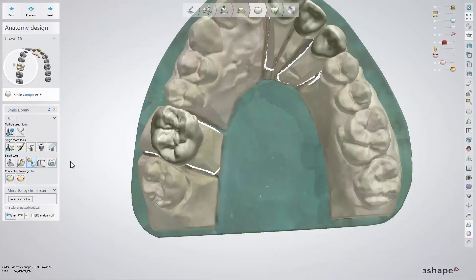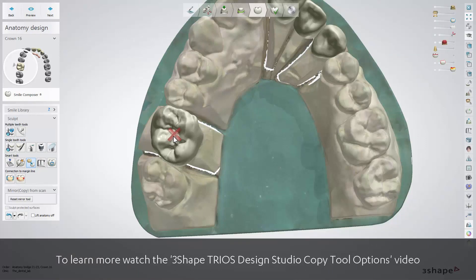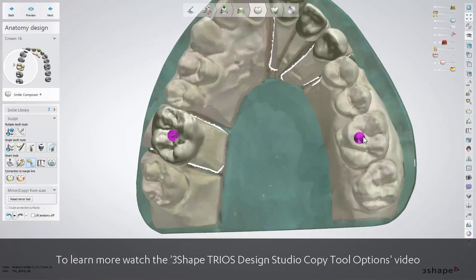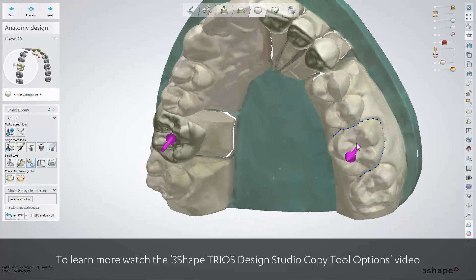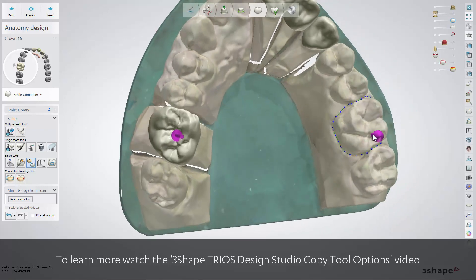Mirror tool. To learn more about the Mirror tool, please watch our 3Shape Trios Design Studio copy tool options video. The icon and the principles of work of that tool are the same in both versions of the software.